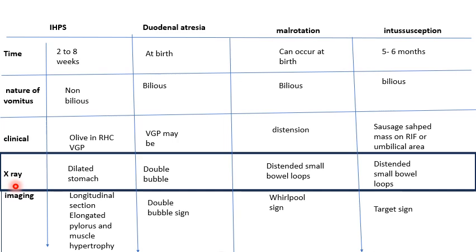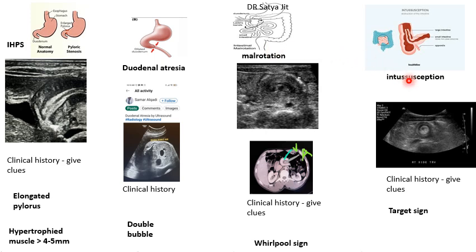So, as I told you, X-ray and ultrasound we had seen. Now, let's look at what each particular diagnosis, what type of ultrasound it will have. Now, don't run into the images. Please do stay with me to understand.